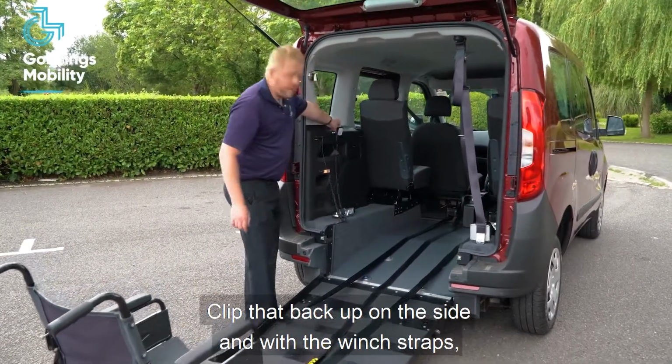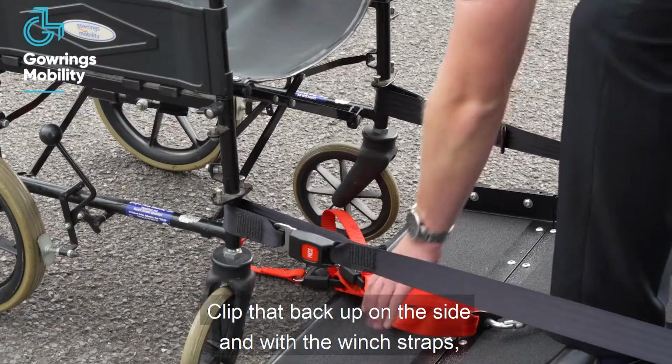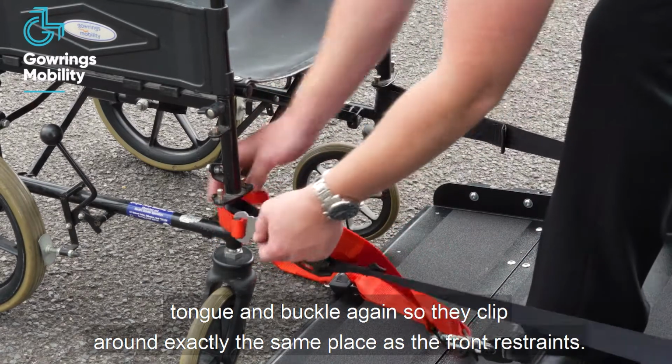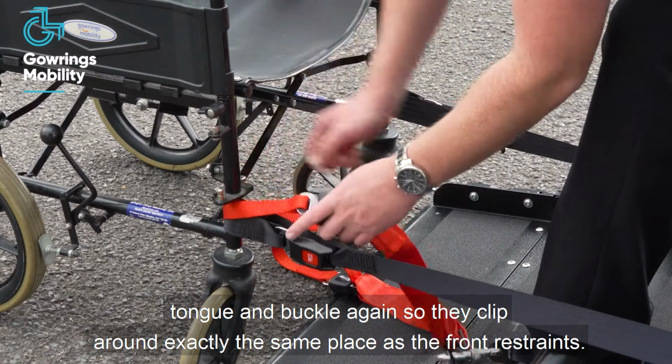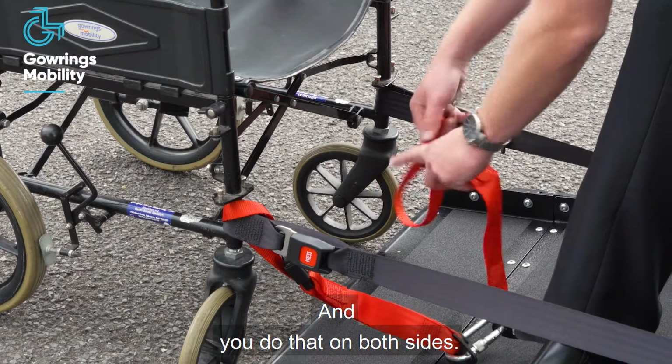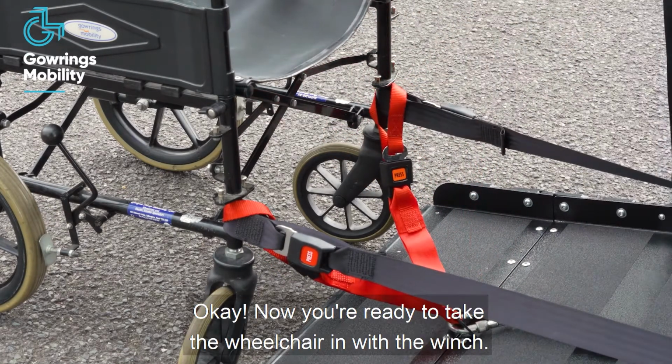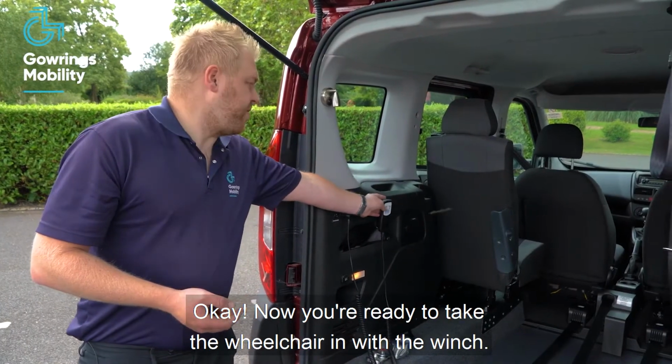Clip that back up on the side, and with the winch straps, tongue and buckle again, they clip round exactly the same place as the front restraints, and you do that on both sides. Now you're ready to take the wheelchair in with the winch.